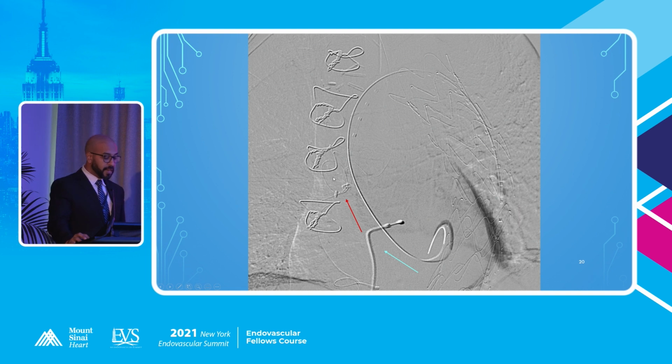And so then we took the patient back to the operating room for the endovascular portion of the procedure. And what you can see there on this red arrow is a pacing wire that we placed around our anastomosis in the operating room when we took the patient for the bypass. And that's to help us figure out where exactly our landing zone is going to be.